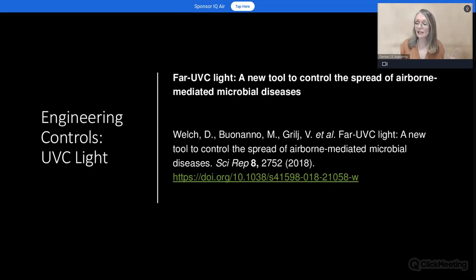UVC lights may affect laser glasses. Yeah, they degrade. Oh, hi, Dr. Cutcliffe. Yeah, that's correct, so we do have to think about that. UVC germicidal radiation or germicidal lighting: you'll see these devices that are good for putting your cell phone or tablets in, and so forth, but they're not specific for everything we're concerned about in dentistry.